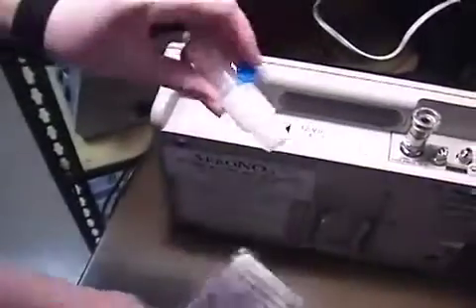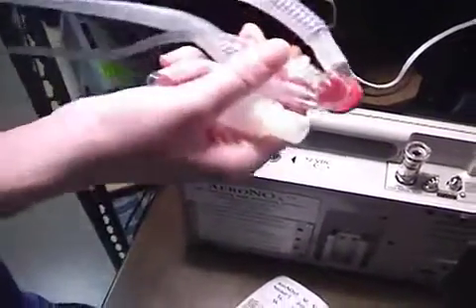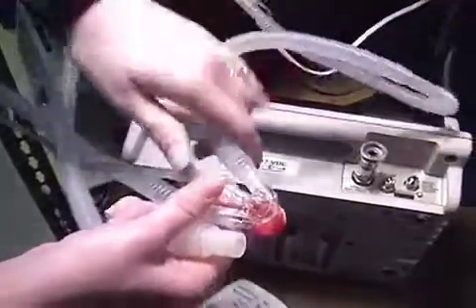Begin by placing the T-Connector Sample Port for Neonatal and Pediatric into the inspiratory limb of the circuit adjacent to the Y.